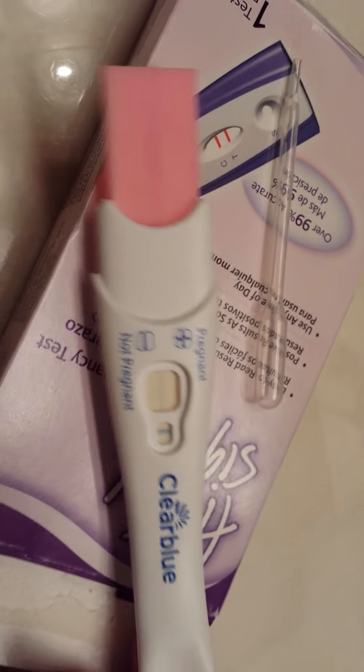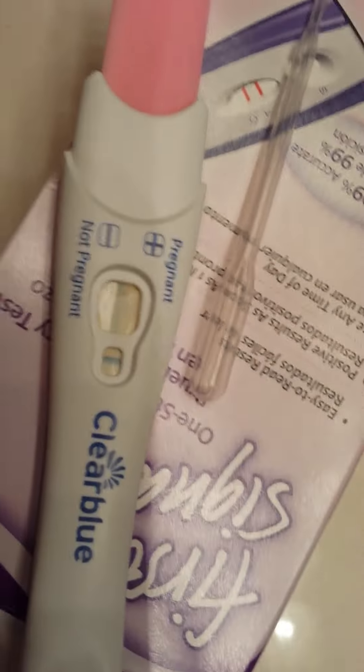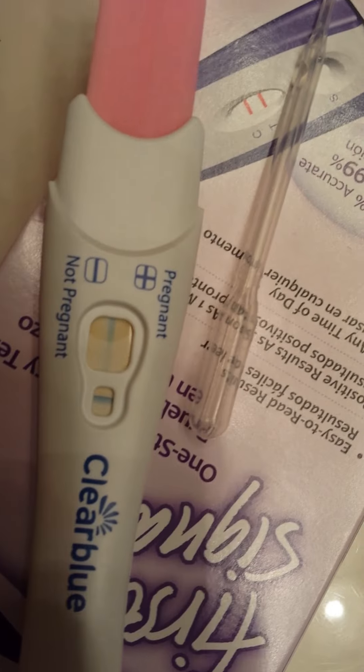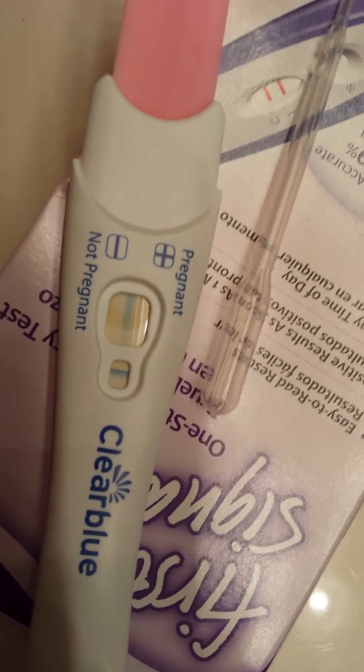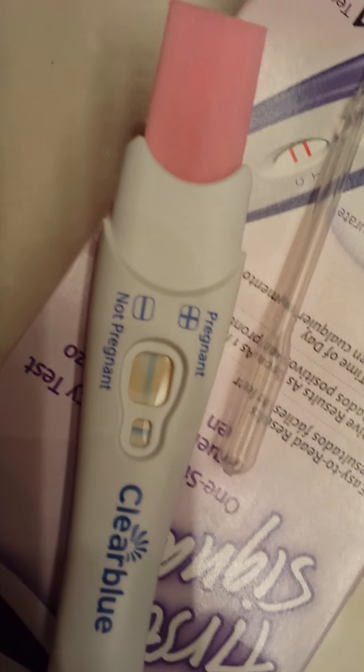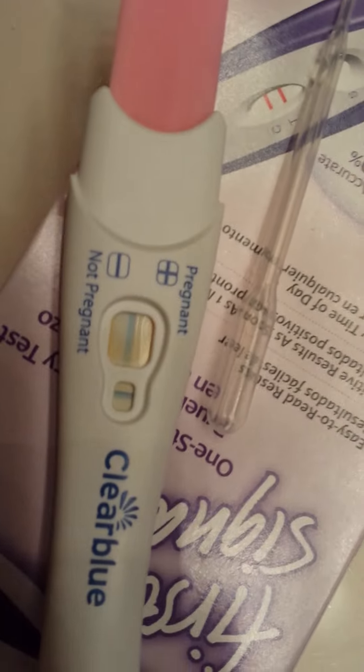I don't even think I see an evaporation line, which is pretty cool because from what I've read, a lot of blue dyes definitely have a problem with that. So let's stick it in for five seconds — one, two, three, four, five. And then we will wait and see if anything happens with this one. Definitely see urine moving across that. And basically it's just resaturating it and making it darker — the line that was already there.